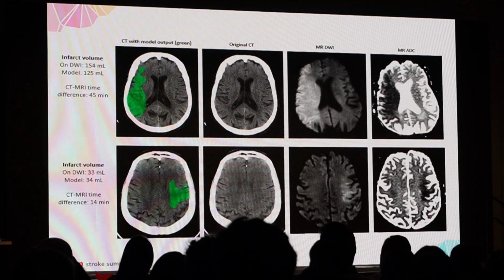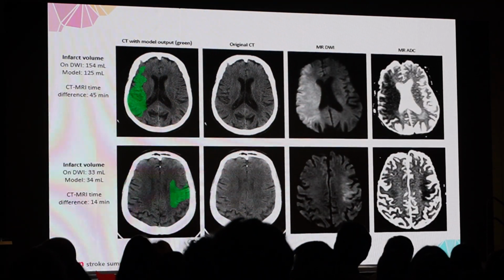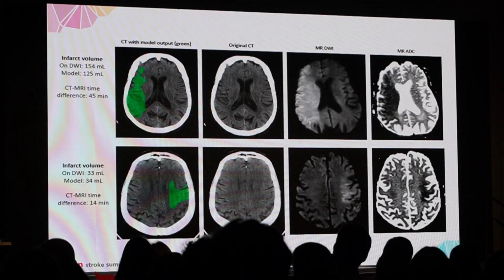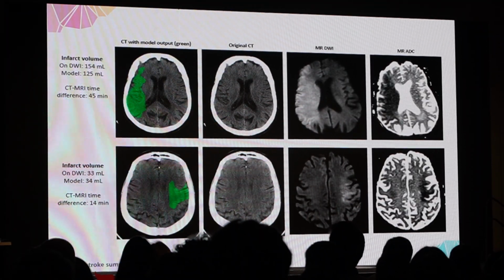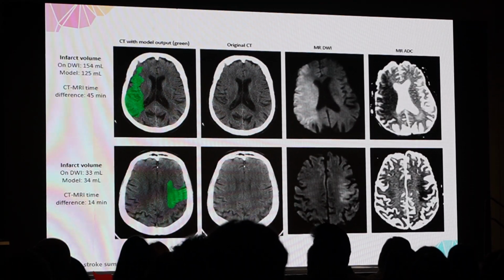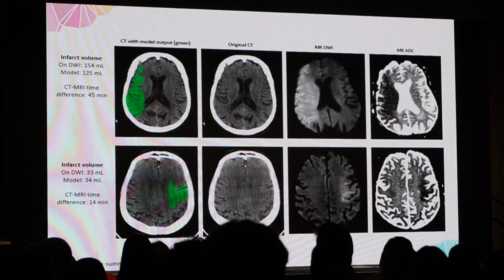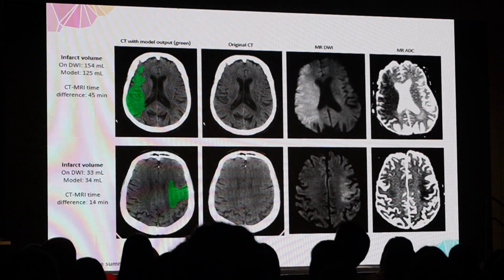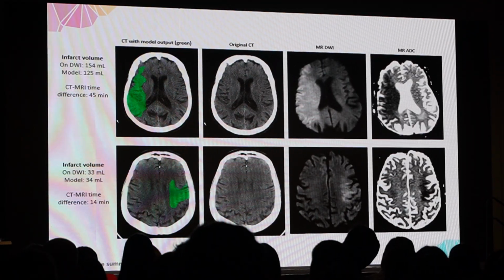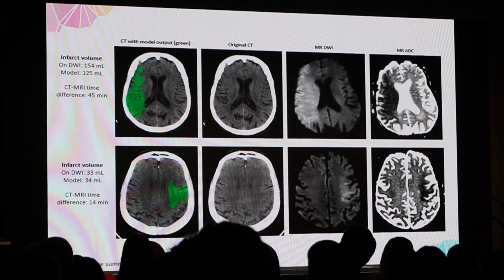because I'm going to tell you I hate CTP. We don't like CTP. But there's some things it's good for, but not for selecting patients for treatment, because it has excluded patients unnecessarily. With CTP, you overestimate the core when you're really looking at the penumbra, and patients have been excluded from treatment who would have benefited, just because you're overestimating the core. So I don't like CTP. I don't think it should be used. It's useful, but not for making the thrombolysis decision or the EVT decision.